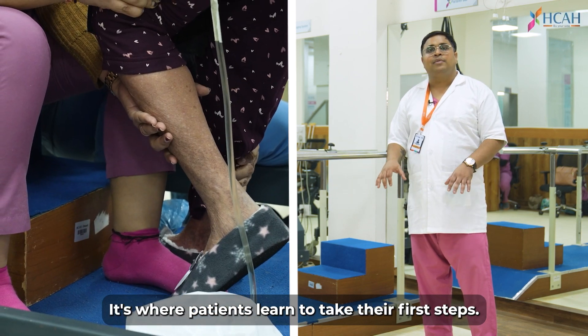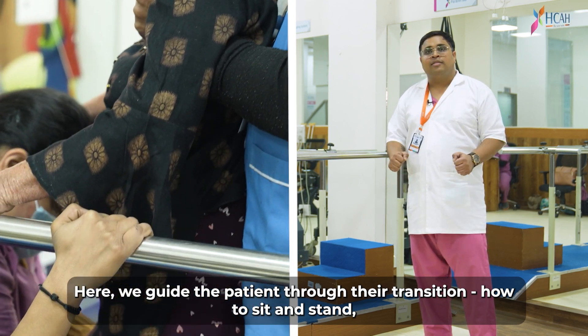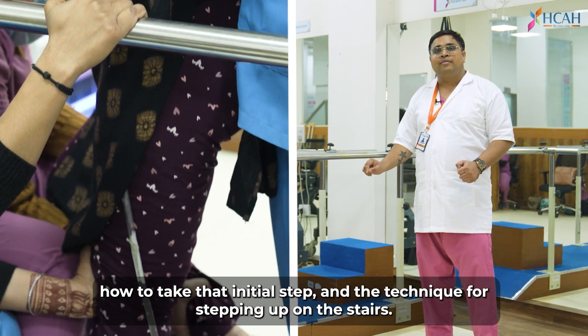Here the patient is learning to keep his first step. We teach the transition of how to get up, how to sit, and how to keep his first step.